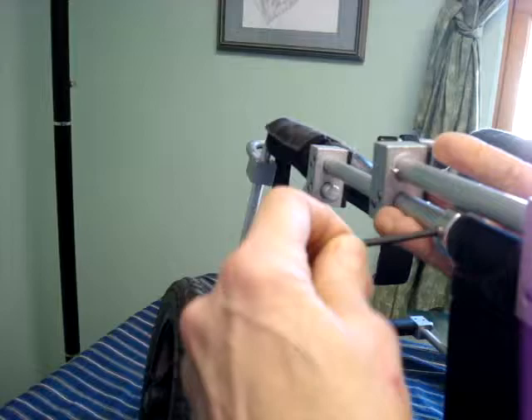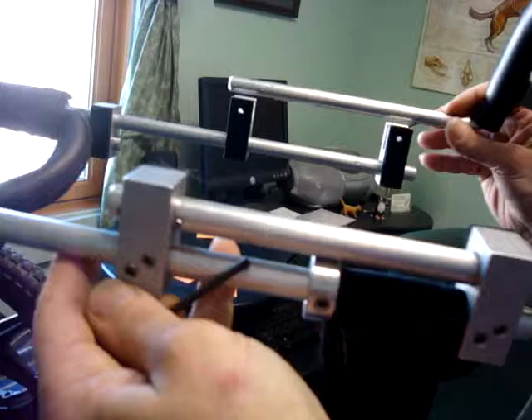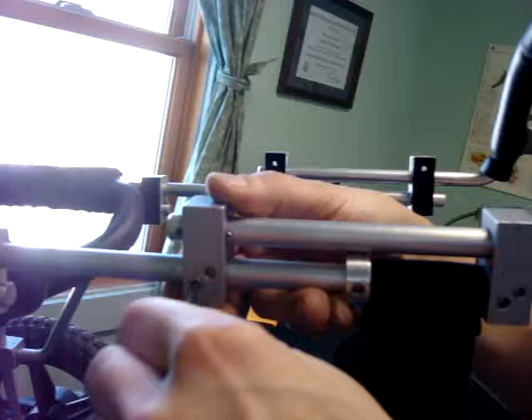I'm just going to tighten the collet here for now. Now you can see, by having this resting in the block on the other side, where this block needs to go back to.